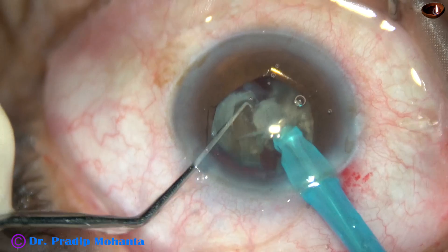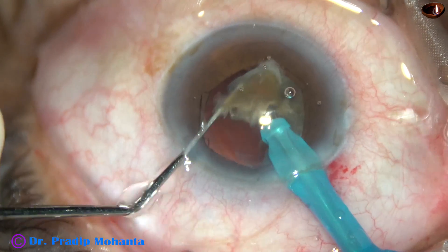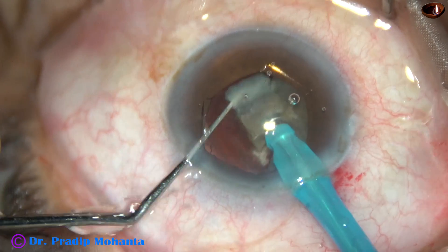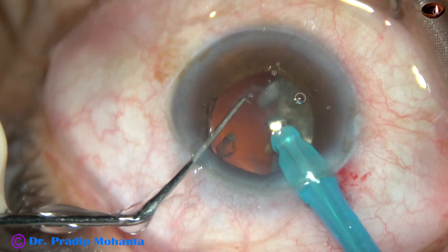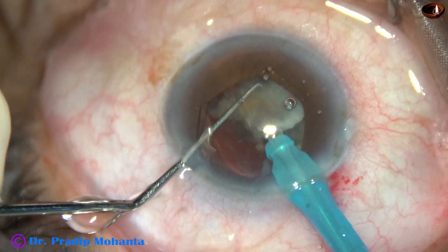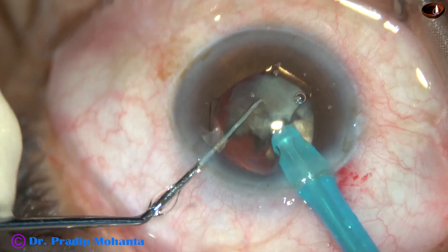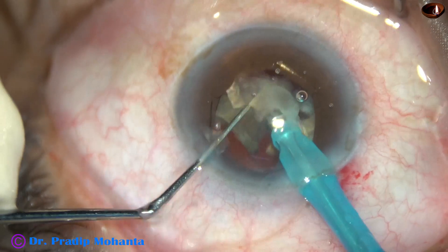And see the main wound — you will never get wound burn with Oatly because the phaco needle shaft is thinner and narrower, and there is a lot of BSS around the shaft of the phaco needle.